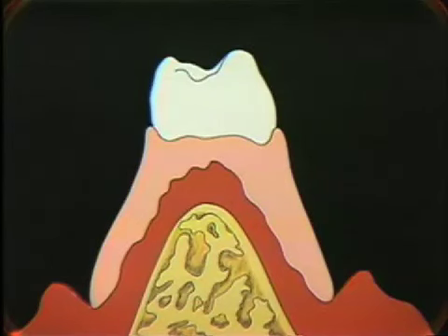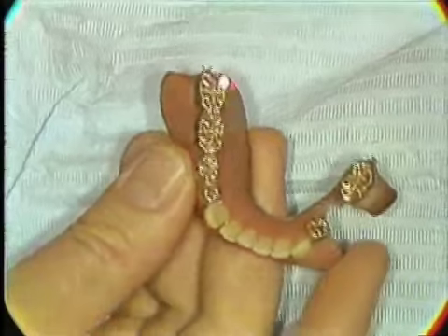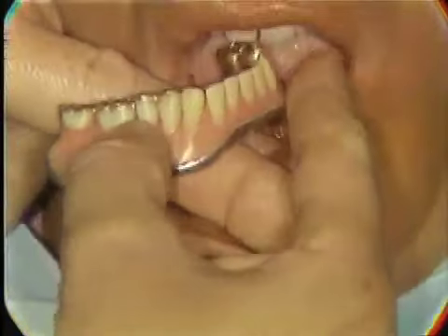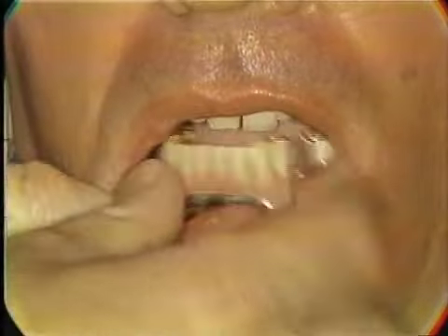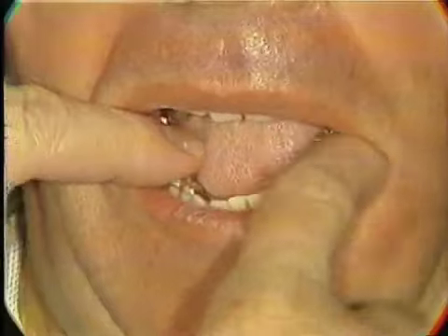So if we have our final base, we can check for the accuracy of the base. Here we have the final base. We can check to see if we have stability of the base by placing the base in the mouth. Go ahead and put that in, Wayne.